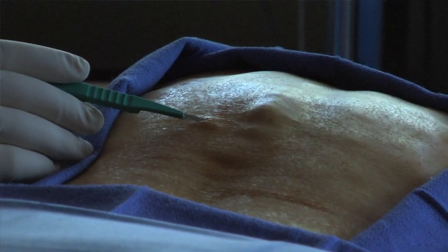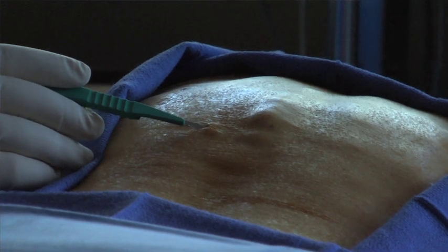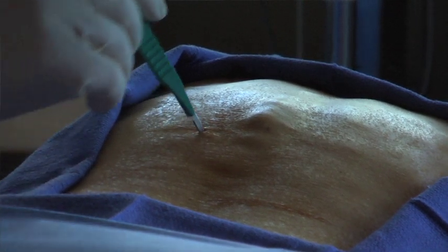A small 3mm incision is made with a scalpel and then a trocar is placed through anesthetized tissue and into the pedicle. This is all done with x-ray guidance.